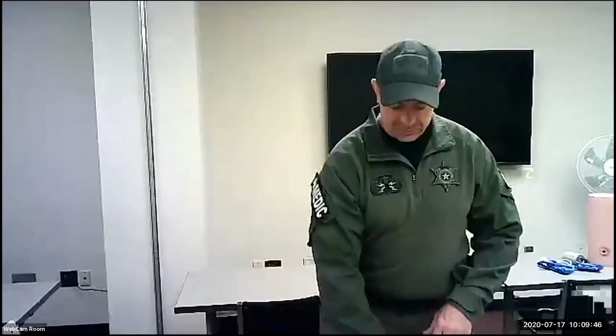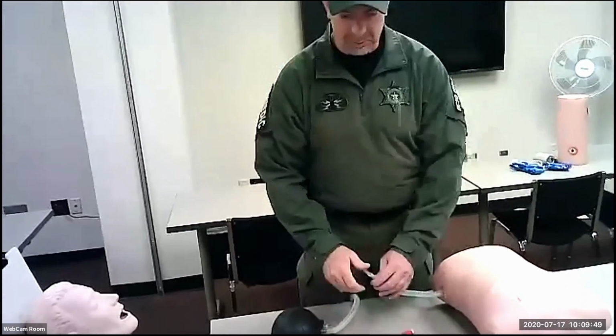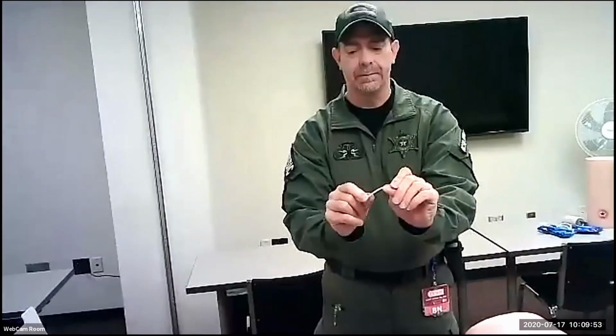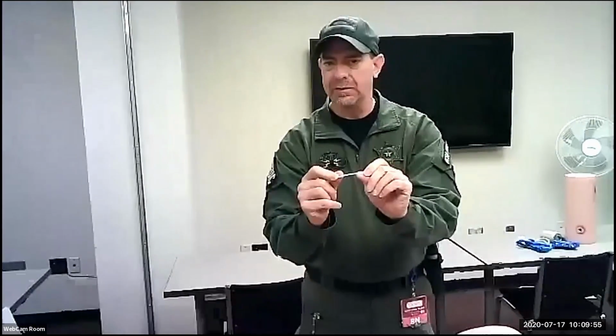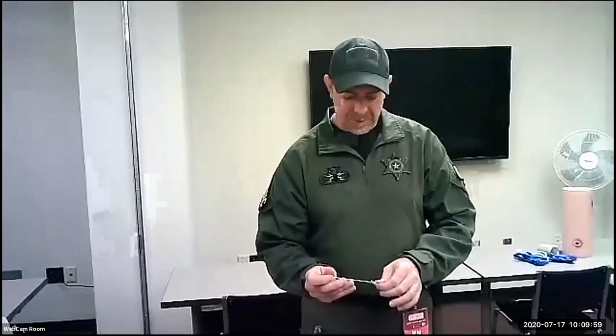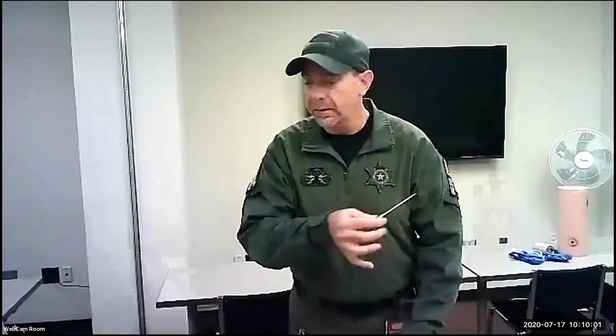All right, so hopefully that video made sense. You saw the lung expand. It's an incredibly cool video. You saw the needle go in. That's not a sharp needle. People always wonder, well, that's going to puncture the lung. It rides on top of the lung. This needle is actually plastic. Okay, you see it bending. It doesn't damage the lung at all. So you saw that lung re-expand. That's the goal of this whole thing, to get that lung to expand again so they can breathe.